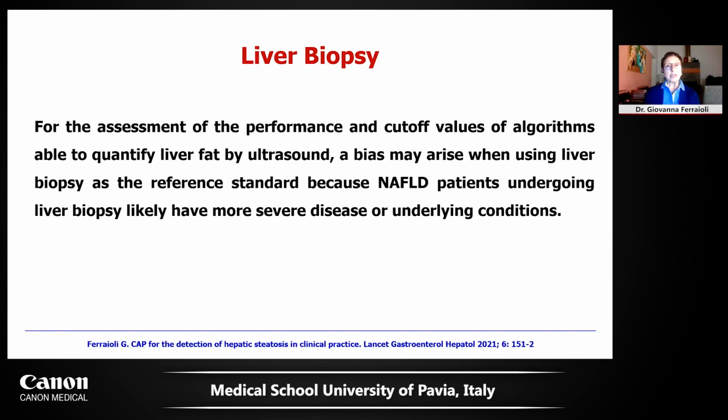Liver biopsy is the reference standard for the assessment of diffuse liver disease and also for the assessment of the fat content in the liver. However, liver biopsy cannot be applied to the vast majority of patients just for screening of liver steatosis. In 95% of cases, NAFLD is a benign disease with only steatosis.